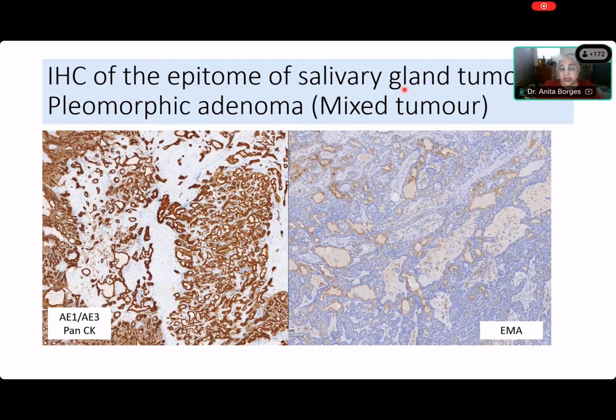Okay, very good. All right. Anything else? You don't see anything else? What are you seeing here? Can you see? I marked something on the right-hand side. In the right-hand side picture, and there's more of it over here as well. What are you seeing, Soumik? Yes, I agree. This is a nice, big cribriform structure.